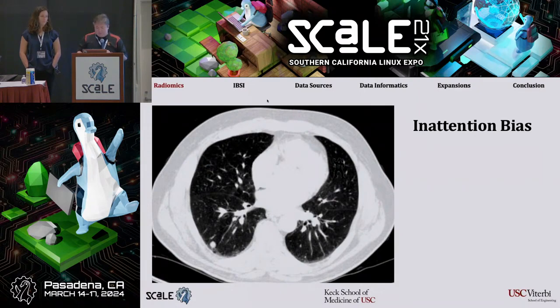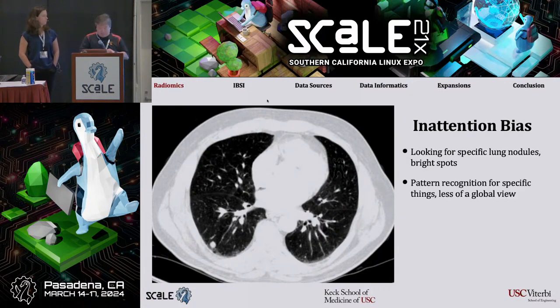So radiologists are trained to find differences when looking at images. And they're trained very specifically for specific reasons. So if you tell somebody, hey, we're looking for lung cancer, and you give a radiologist a scan like this, they will be able to spot the cancer, which is, let's see, there we go, right there.